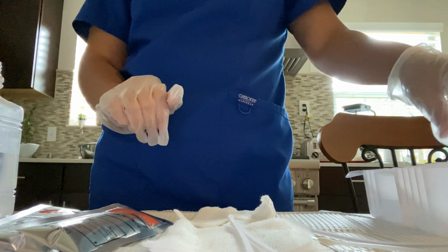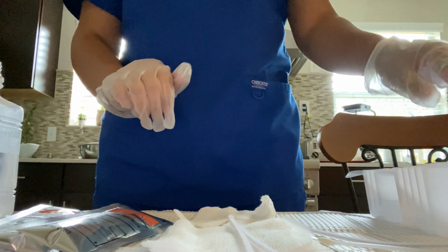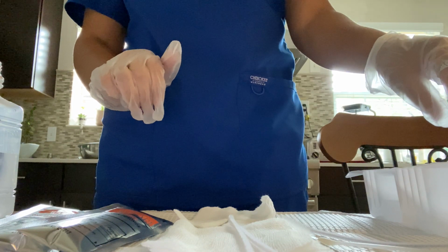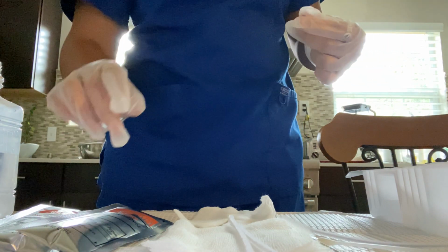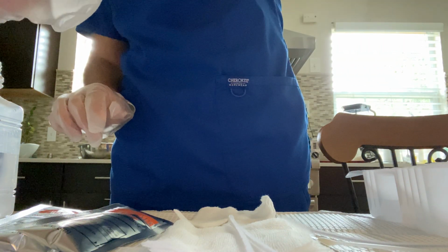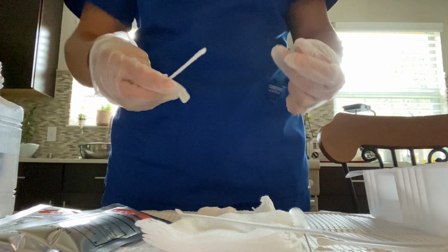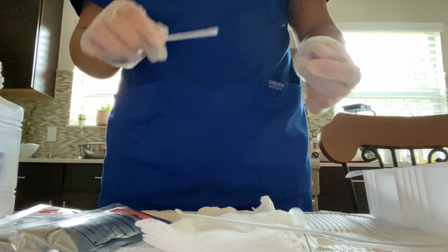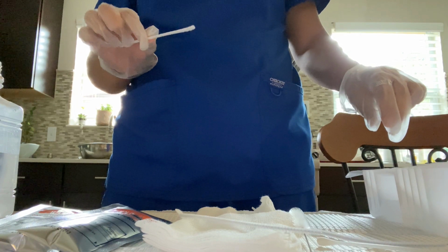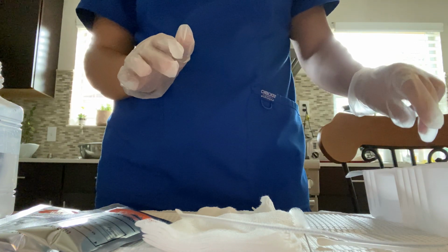Put it in the dirty basin, and then after that, we'll just let it soak over there. Then we'll pick up the trach with the dirty hand, and then we will clean it. I'll grab a clean one here. And then we'll clean it. Okay, clean. And then we'll let it soak. I'll toss this. Over there's my trash. And then we'll let it soak.